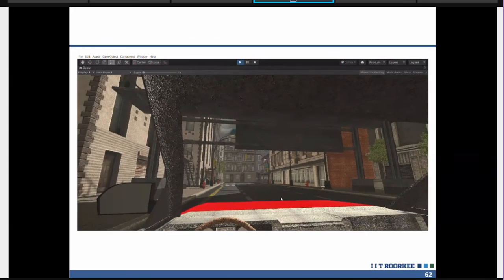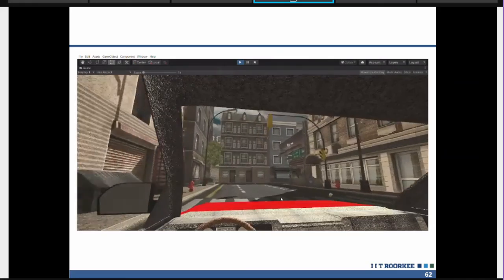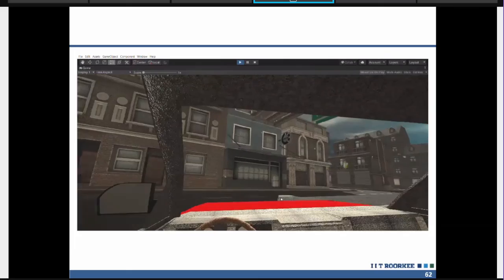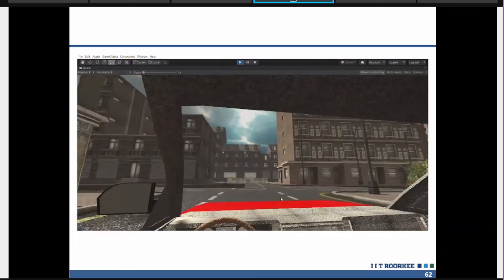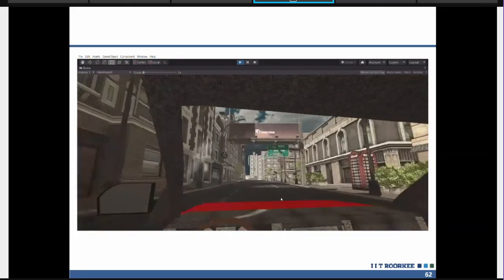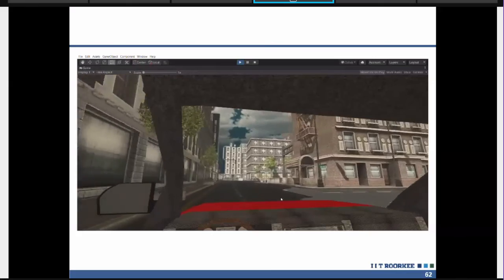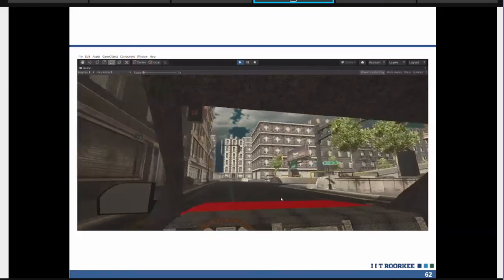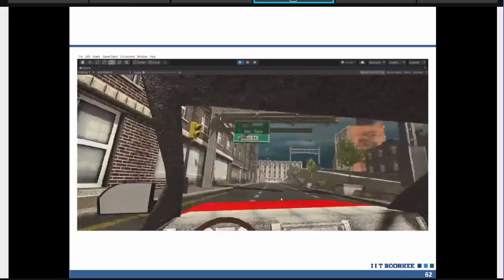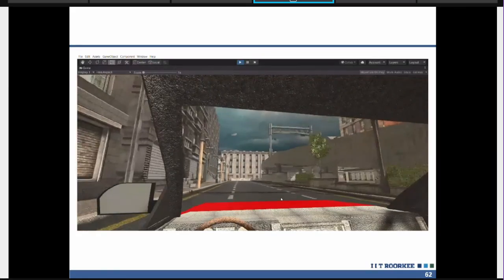This is the environment developed in augmented reality and virtual reality, and the person needs to answer these kinds of questions. While they answer, we collect the EEG signal and analyze the mental workload, how much it is. This environment was developed by ourselves.